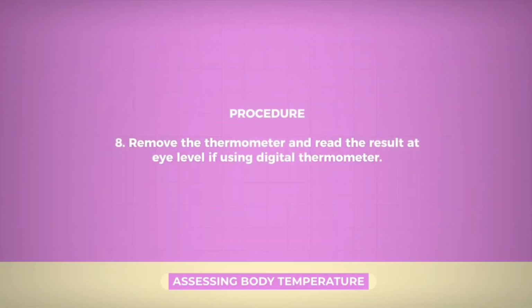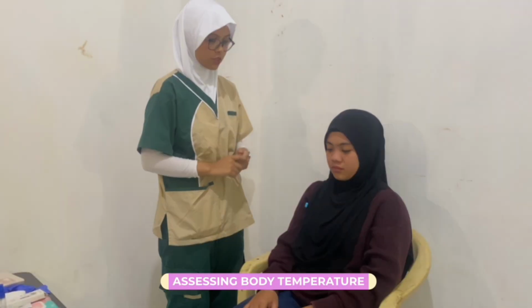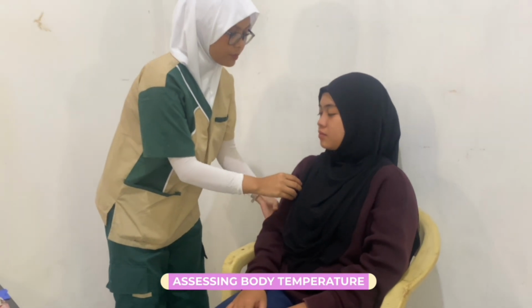Remove the thermometer and read the result at eye level if using a digital thermometer. Reading at eye level ensures accurate interpretation of the temperature measurement. So ma'am, I will now remove the thermometer.